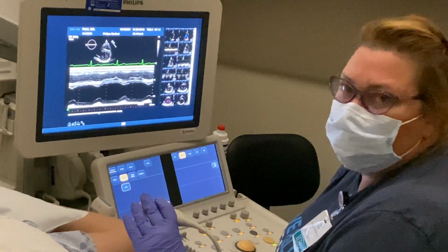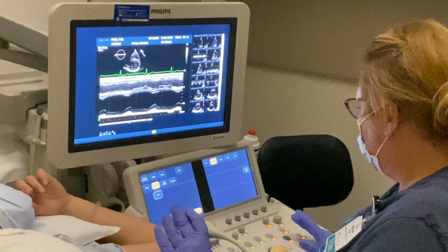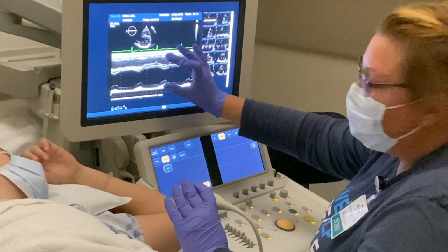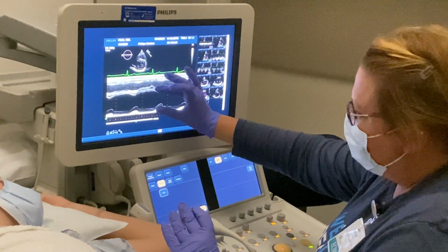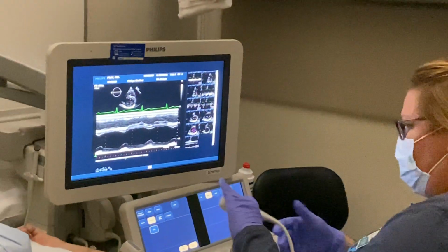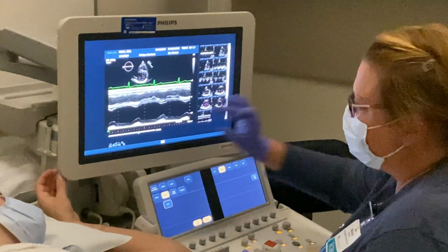We'll get some more practice in measuring when we go to ProSolve. But we would clip this as well. As you can see, the M mode is showing us the motion versus the time. So this is diastole or end diastole, and then when it comes together, it's end systole. So it's nice and relaxed and open diastole. When it comes together, systole.